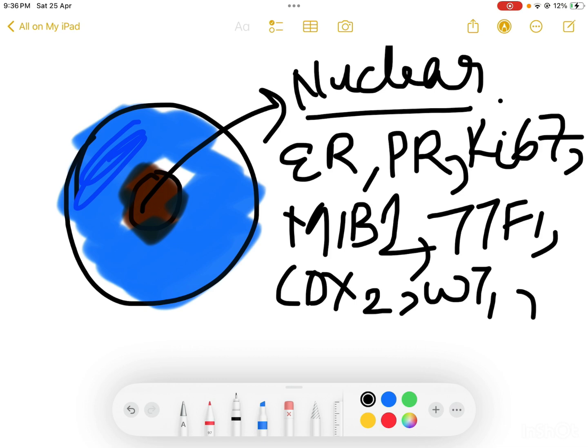There are also tumors which do not express more of the estrogen receptors. In that you will get negative or very less IHC positivity. So these nuclear positivity or the IHC markers are used to identify the tumor, as well as you can use it to identify the normal tissue also, like which tissue is what we are seeing, or whether there is normal tissue or not, but mostly we use it for oncological purposes.